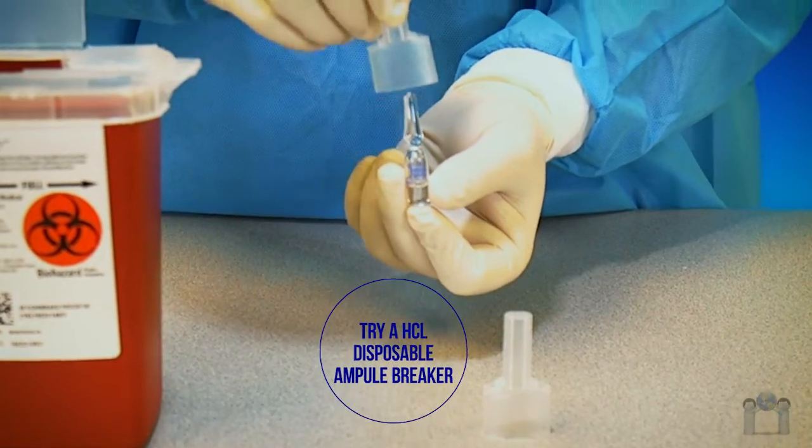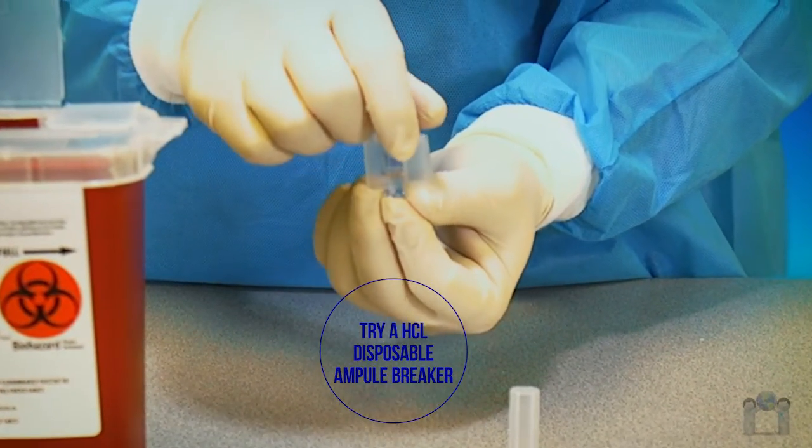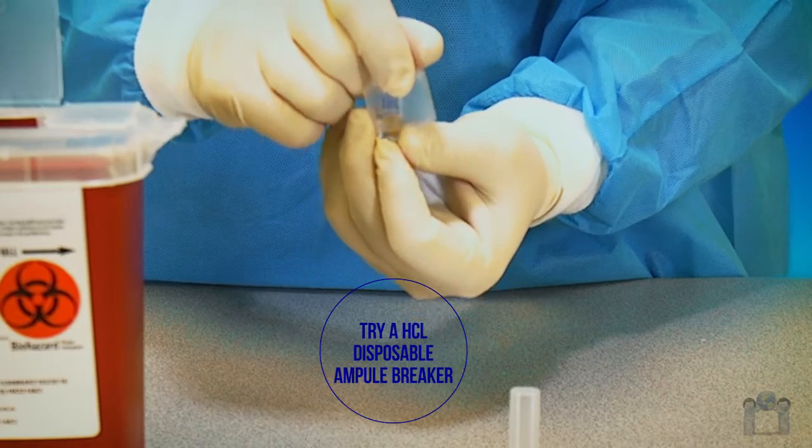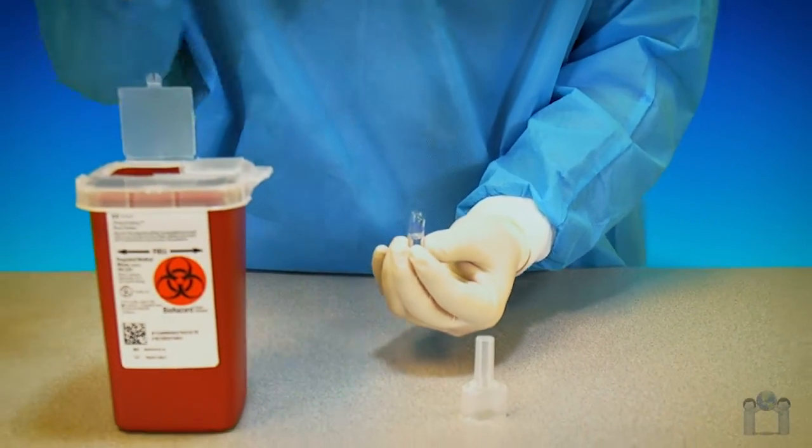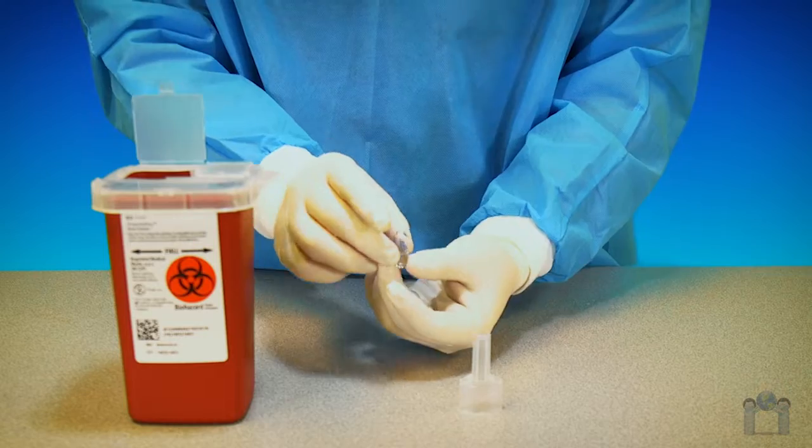Disposable ampule breakers fit over the head of the container and safely snap at the neck to reduce the risk of finger cuts during med prep. Then, both pieces can be discarded together into a sharps container.